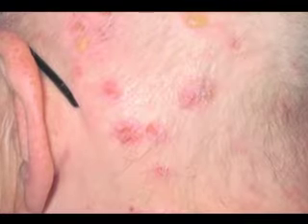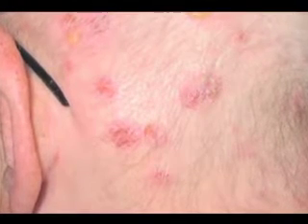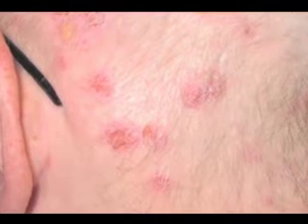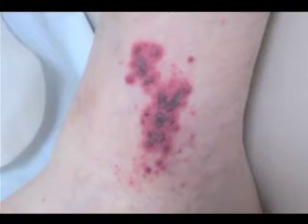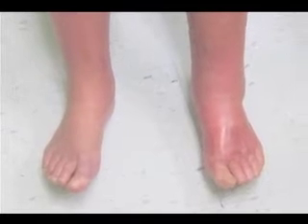Unless a specific lesion must be sampled, the biopsy site should be selected to obtain the maximal diagnostic yield and to minimize adverse aesthetic consequences. Fresh lesions without excoriation or secondary infection will provide the best diagnostic information. A specimen taken from dependent areas such as the lower legs may have venous stasis, which may confound the histologic picture. In addition, the legs often have poorer wound healing and are susceptible to infection.